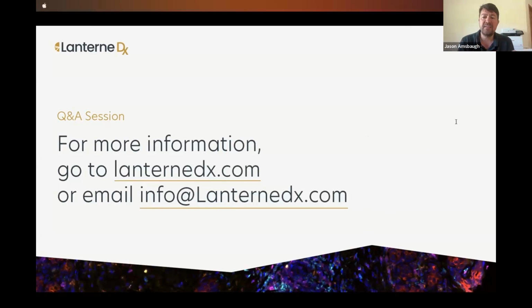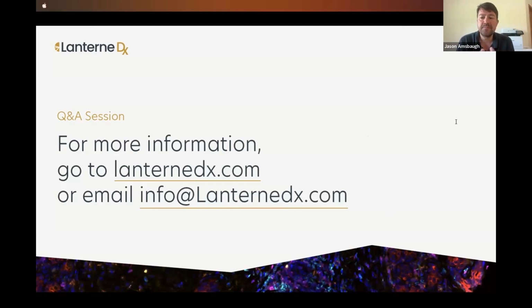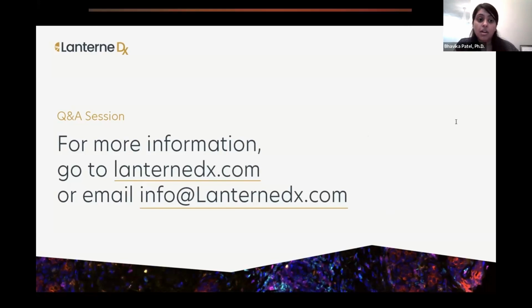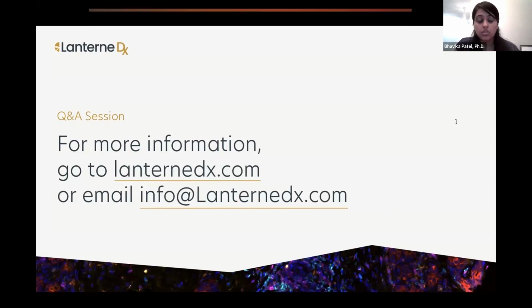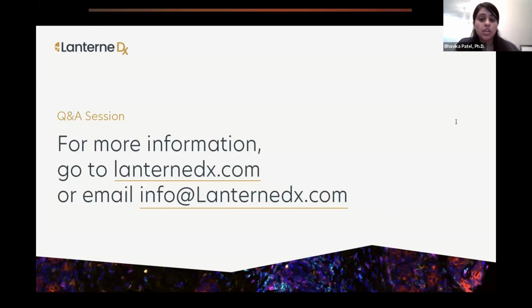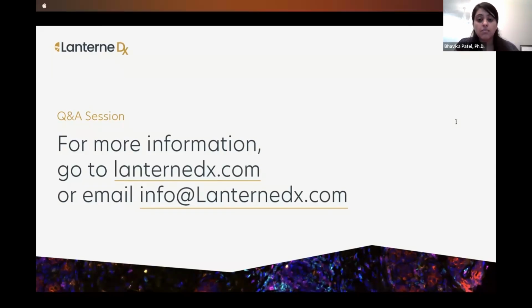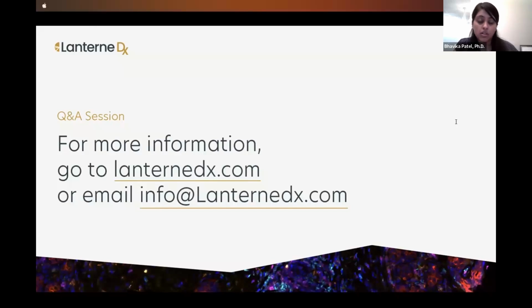Okay, the next question is, how long does it take to create a new 4 to 6 marker panel? Great question. It depends on whether the antibodies in the panel have been optimized via chromogenic IHC. One of the first steps for our lab is to make sure that each antibody has an optimal condition using just the gold standard DAB staining. We can spend anywhere between 1 to 2 weeks for each antibody, and we can do that consecutively since the antibodies do not rely on one another.